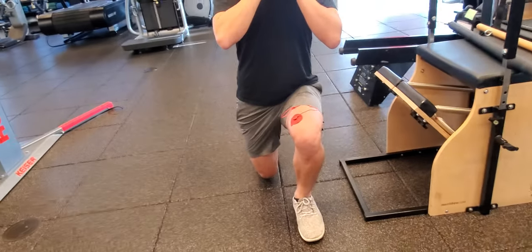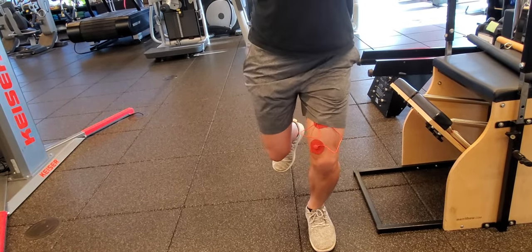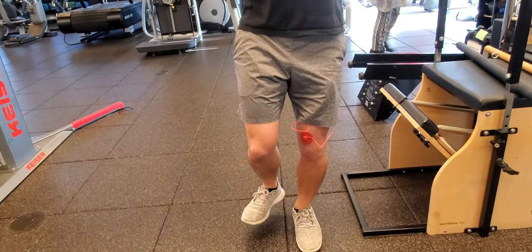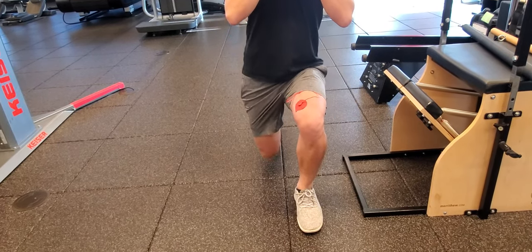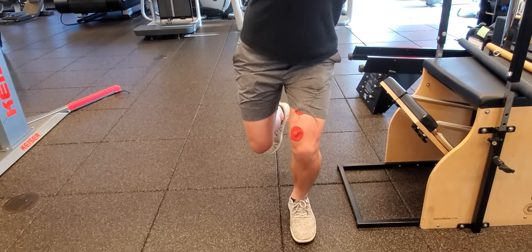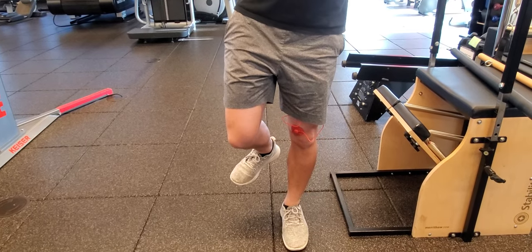From the front orientation — drive all the way up, straighten the knee, feel the buttock. It's okay to have a handhold there just for stability, and with fatigue already setting in — all the way up, straighten the knee, posterior pelvic tilt.